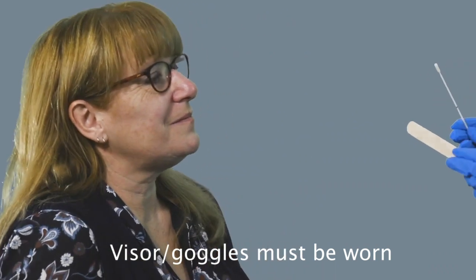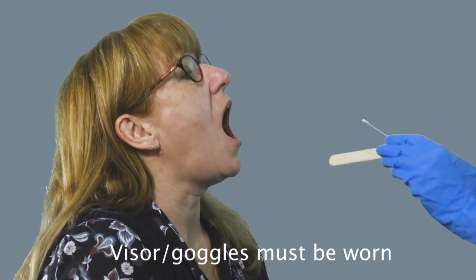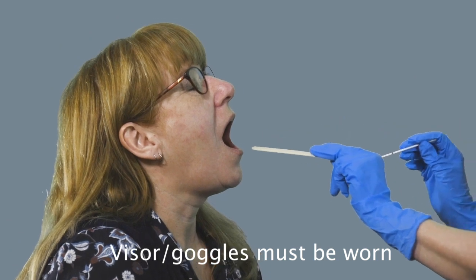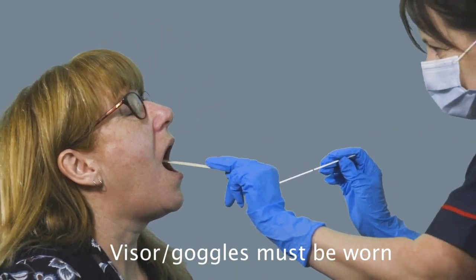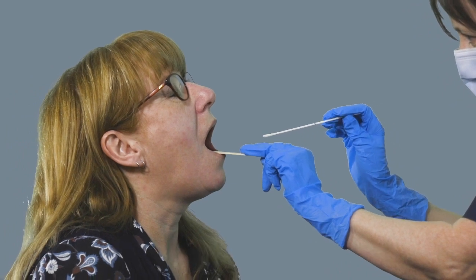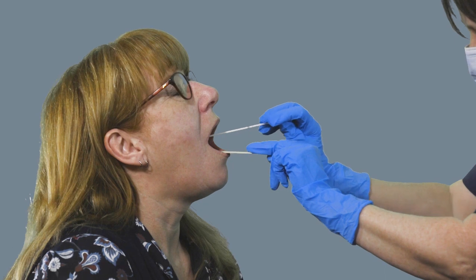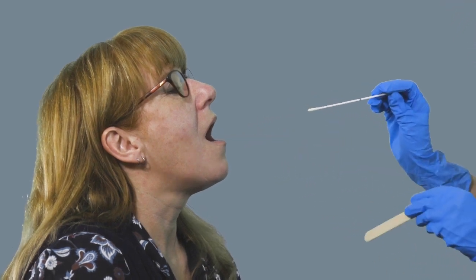Ask the patient to open their mouth wide and tip their head back slightly. Look in and see if you can visualize the back of the throat. If not, use the tongue depressor to gently depress the tongue. You're aiming for the back of the throat into the lumpy bits at the back — the pillars of the tonsils — and just swabbing on either side.